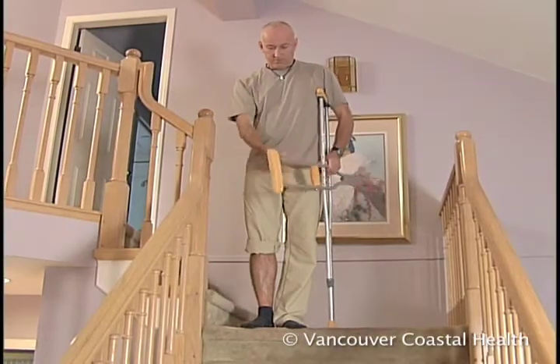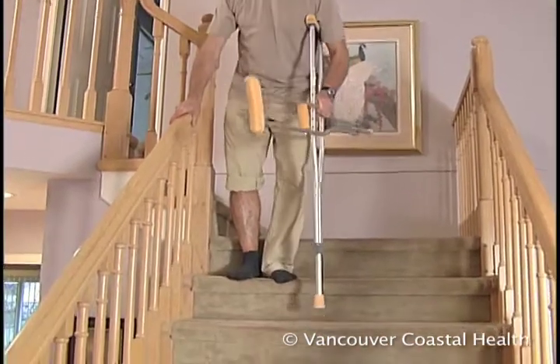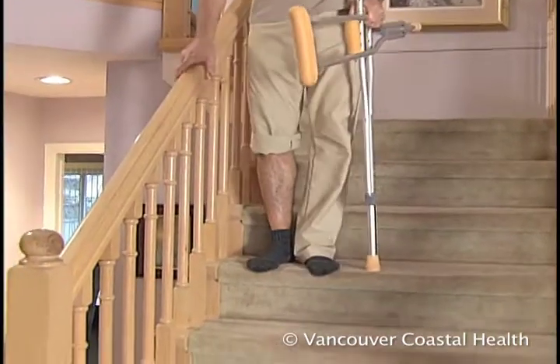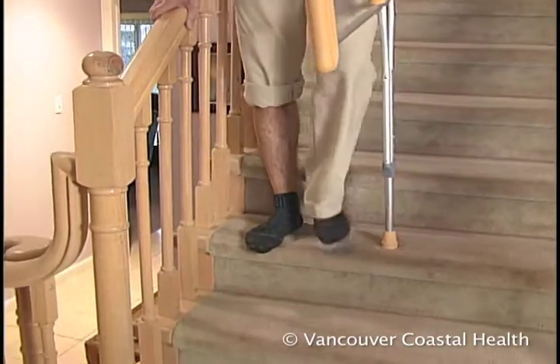When going down stairs, grasp the railing, place the crutch one stair below, and step down with the bad or surgical leg. Follow with the good or non-surgical leg. Repeat one step at a time.